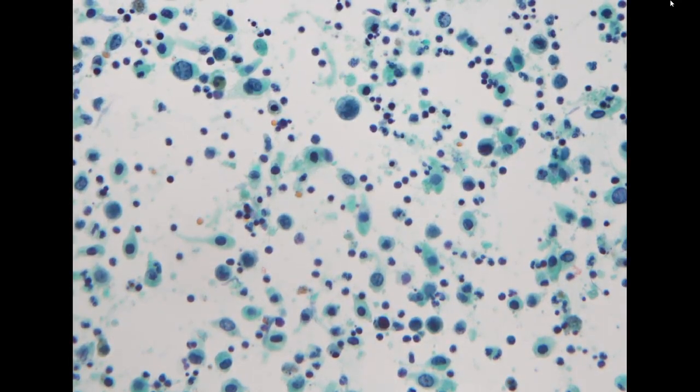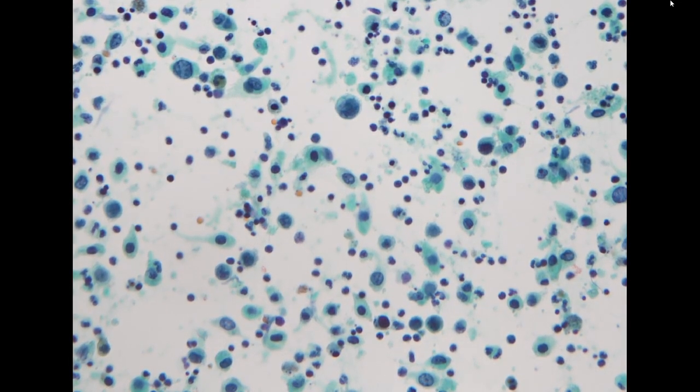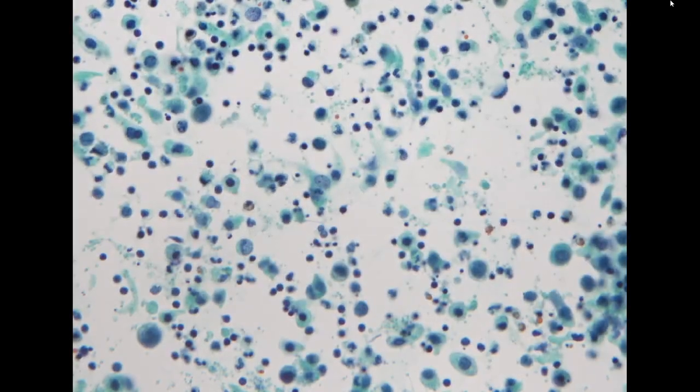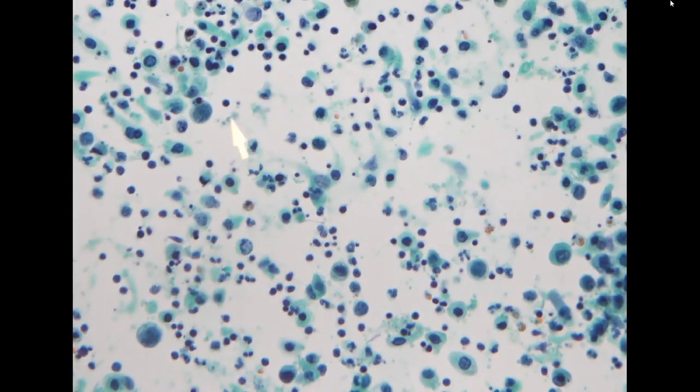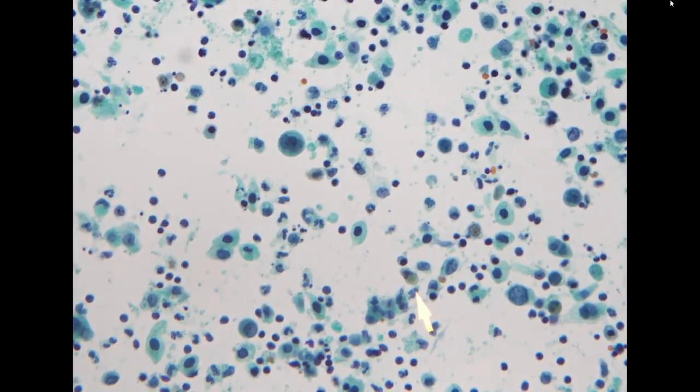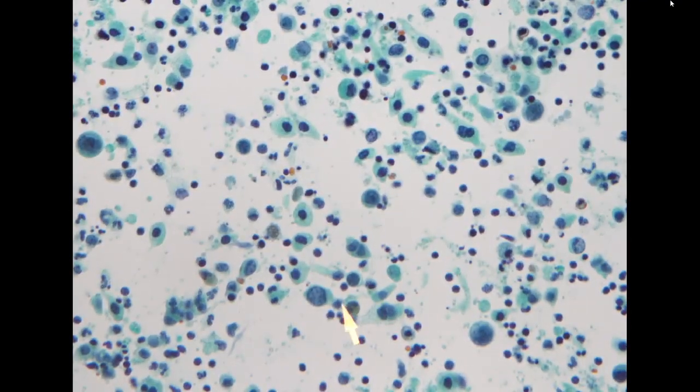The next specimen is from pleural effusion. The patient had a confirmed history of lung adenocarcinoma and has been treated. In this specimen, you can see the background is a little bit necrotic, with some very atypical single cells with increased NC ratio.